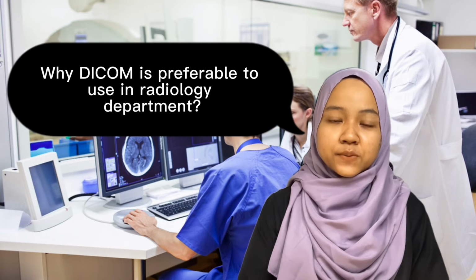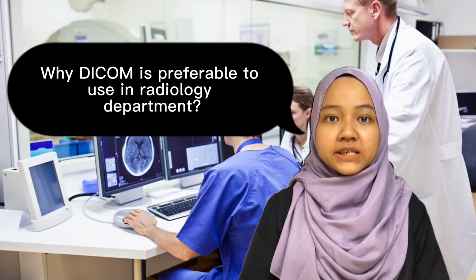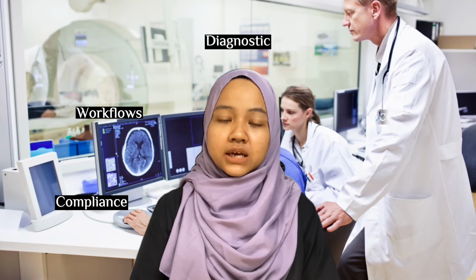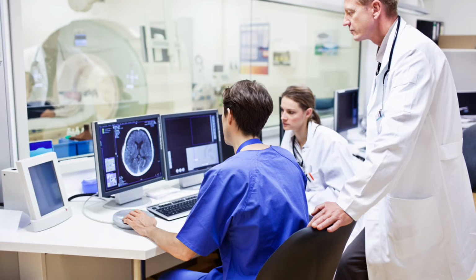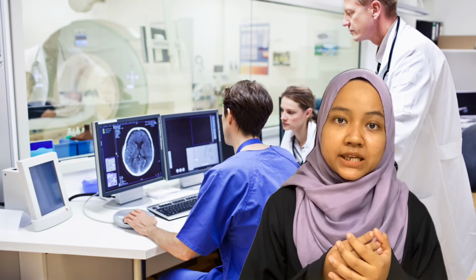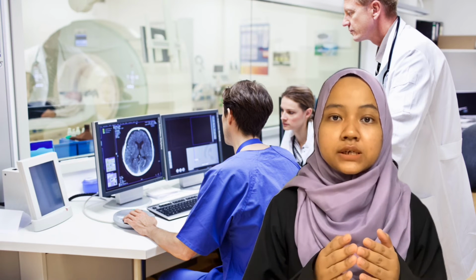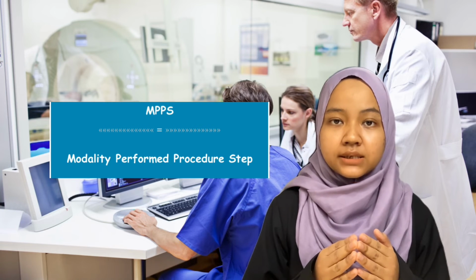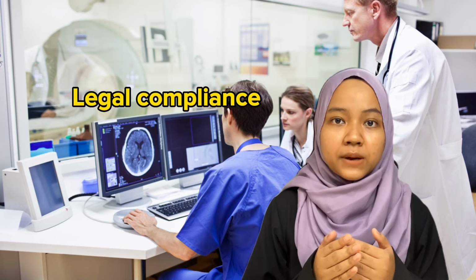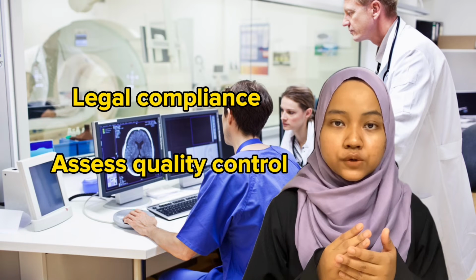Dicom is preferable to use because it is particularly important in compliance, workflow, diagnostics, data accuracy, and administration. First, compliance. Generally, Dicom has introduced the modality performed procedure step, which is MPPS, to enable legal compliance and assess quality control.